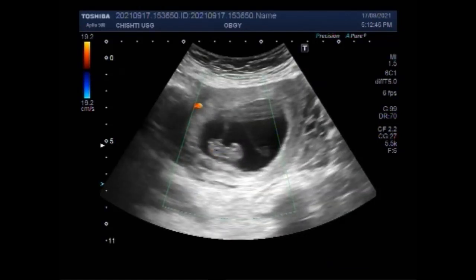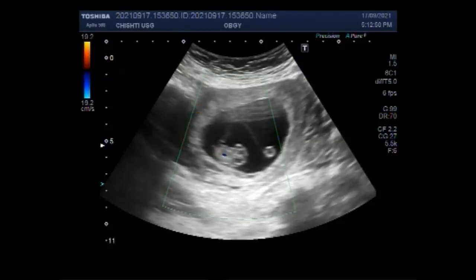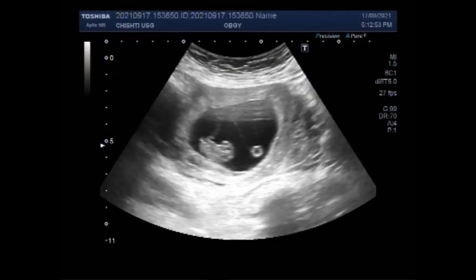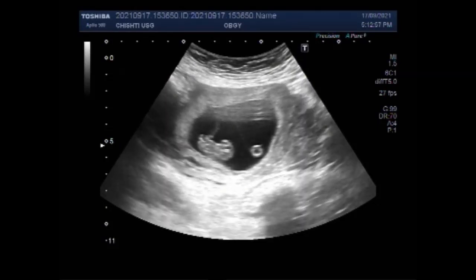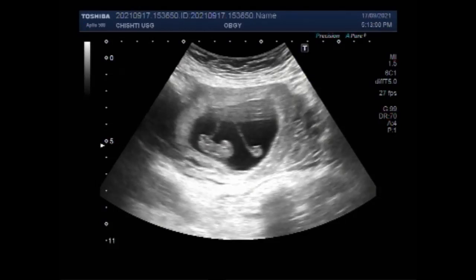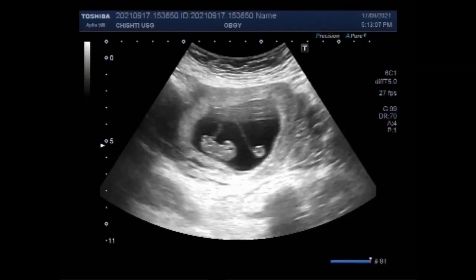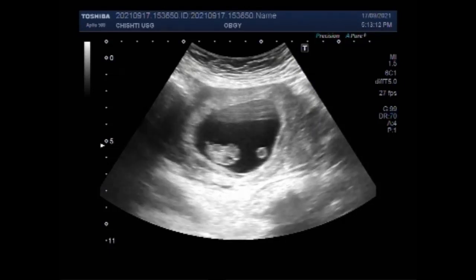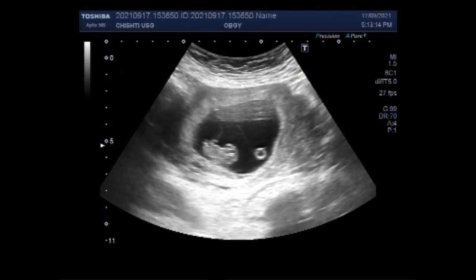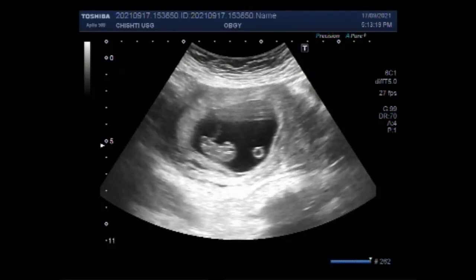The gestation sac is the large cavity of fluid surrounding the embryo during early embryogenesis. It consists of the extraembryonic coelom, also called the chorionic cavity. The gestation sac is normally contained within the uterus. One of the more common types of miscarriage is known as anembryonic pregnancy with an empty gestation sac.